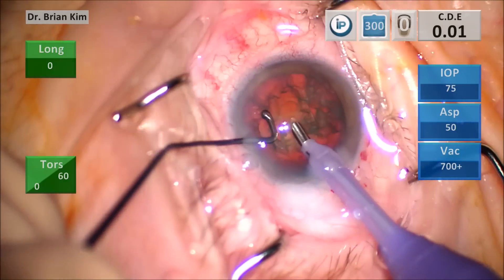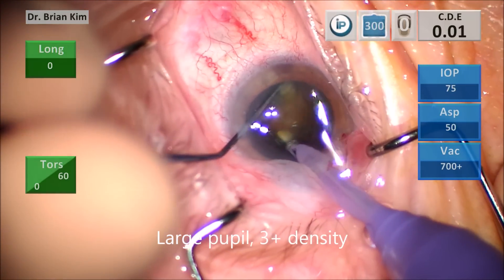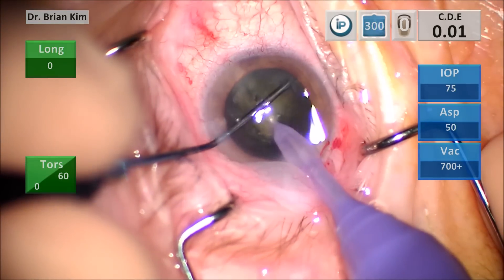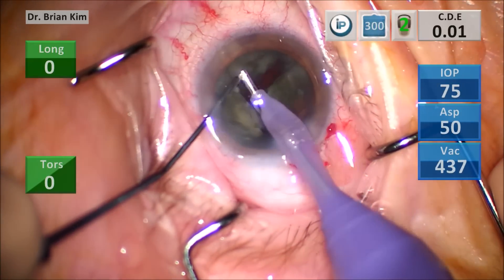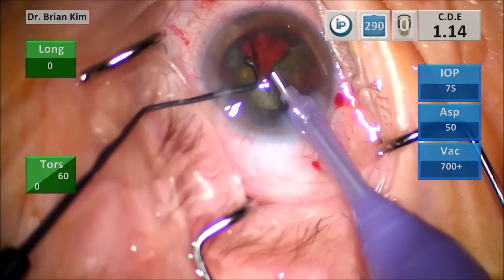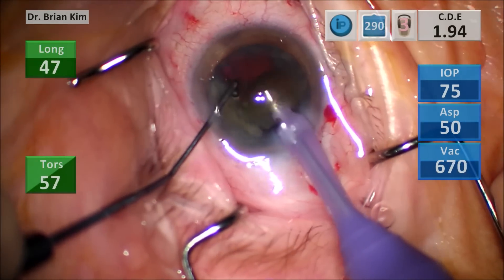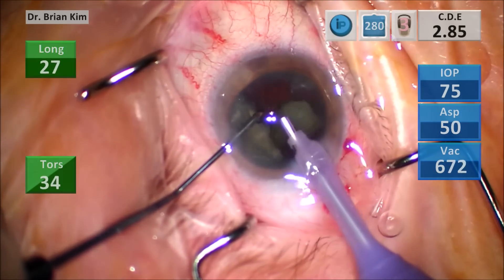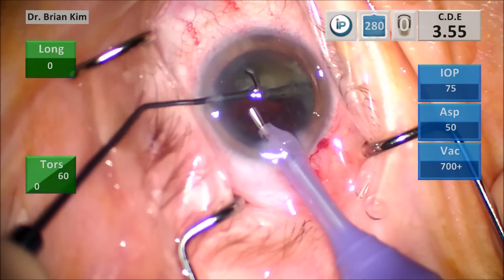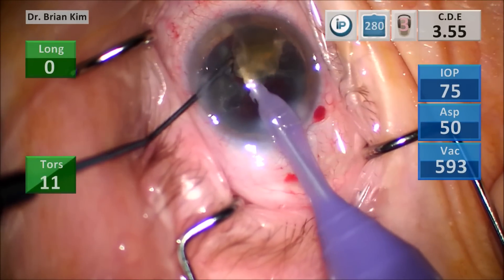This is the very last case — a large pupil with a 3 plus NSC. Chopper going out under the anterior capsule around the equator, same technique. Sub-incision with the FacoTip grabbing them. You can see the whitening of the lens as I'm mechanically breaking them — this is all under foot position zero. Irrigation alone, no ultrasound, no vacuum. The cross-chop breaks up that right hemi nucleus and the lens is emulsified. The chopper is the one initiating all the action, grabbing that proximal quadrant. The FacoTip is in the central safe zone the entire time — I'm not chasing any pieces with the FacoTip, it stays right in the middle. I use the chopper to help access the rest of the lens, chopper going out and around to the equator — all under position zero during the chops, even with these smaller chops. And then ultrasound and vacuum are initiated.